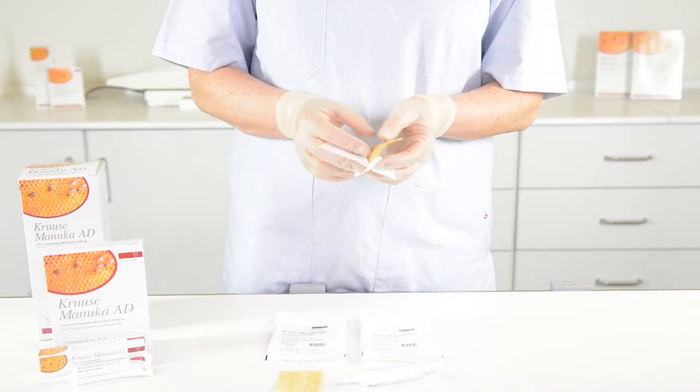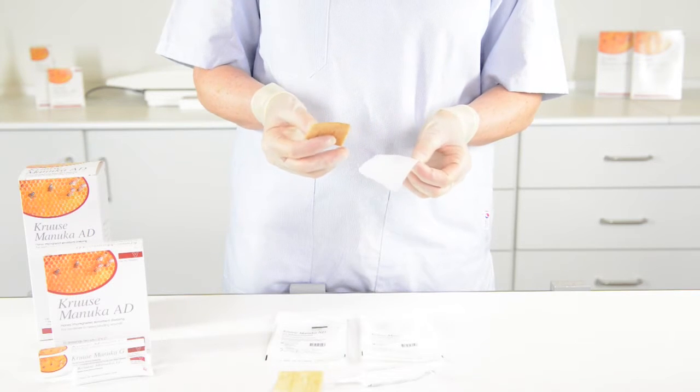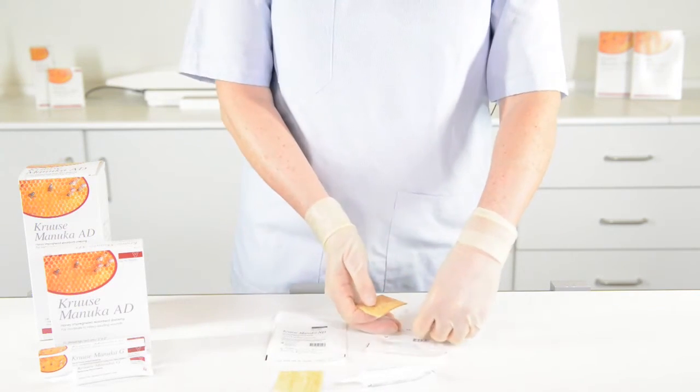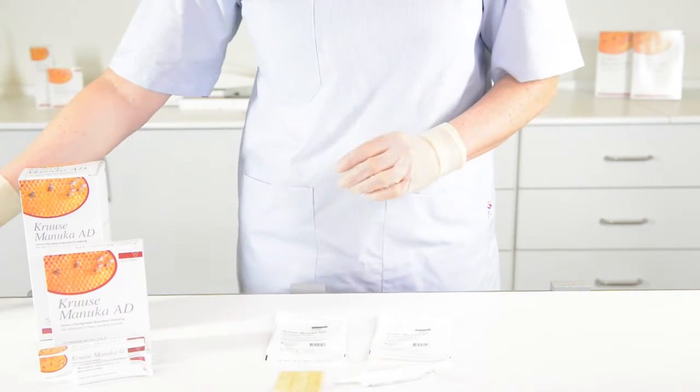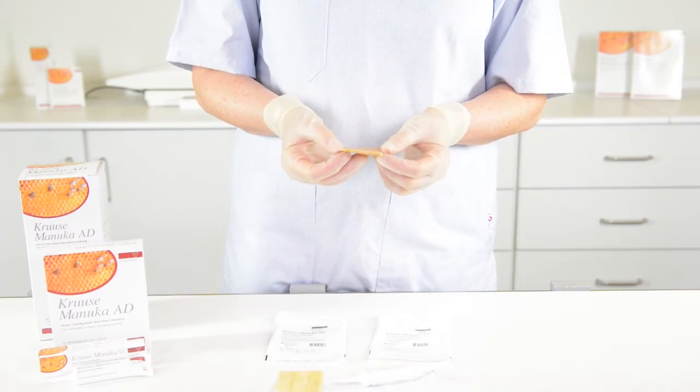When you apply it, it will expand and the exudate will get into the dressing. It will also create a lot of exudate, and therefore you also need to cover it with a secondary dressing.